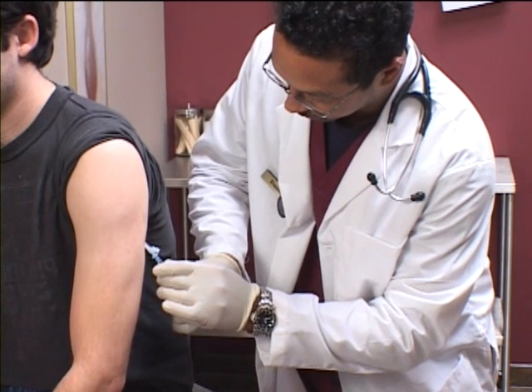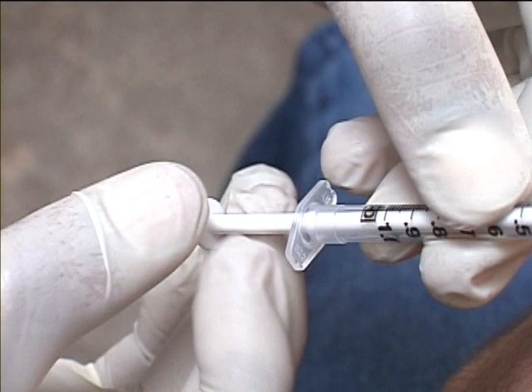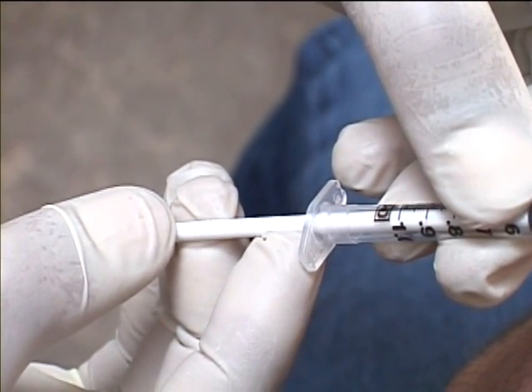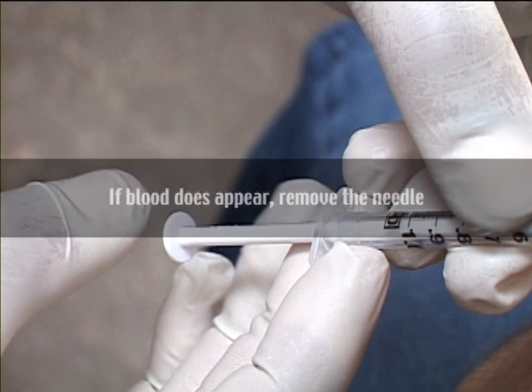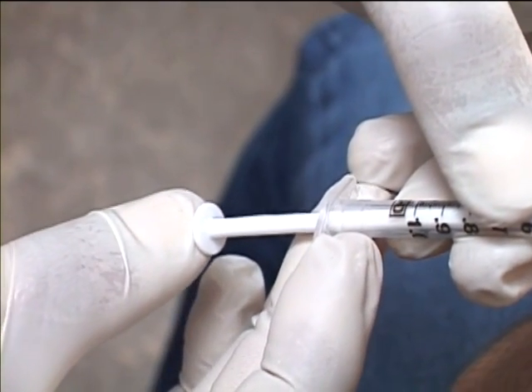The dominant hand should continue holding the syringe toward the bottom of the syringe, and the non-dominant hand that was pinching the fat should now grasp the back of the plunger. Pull back on the plunger to ascertain that the needle is not in a blood vessel. If blood does appear in the syringe, remove the needle and start over. If no blood appears, continue by slowly injecting the medication.